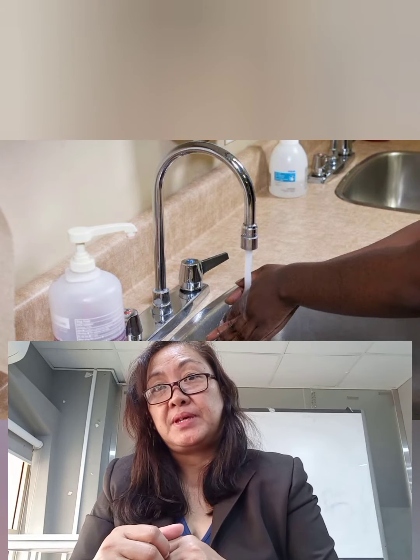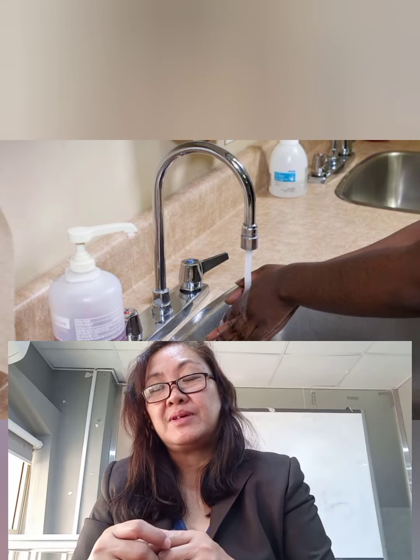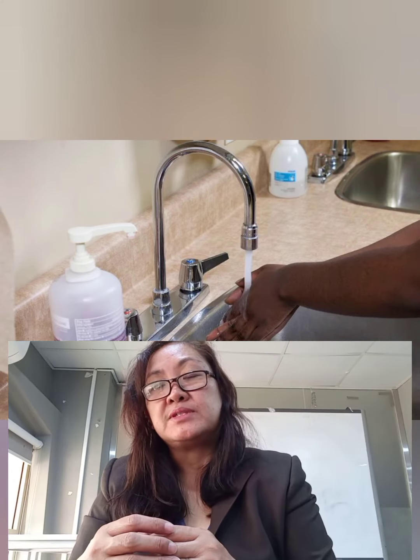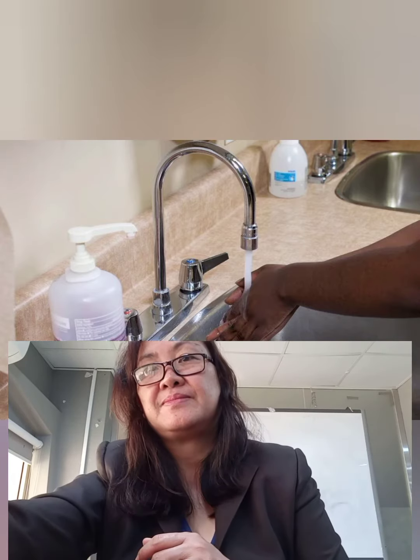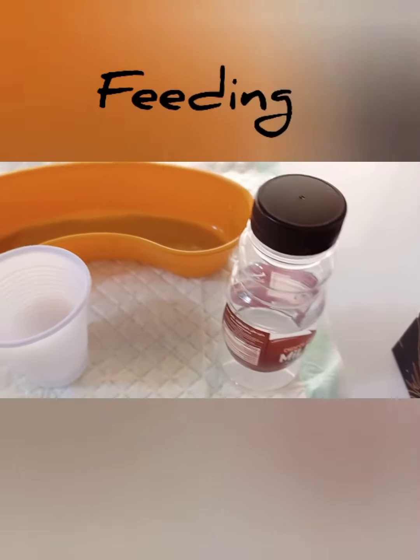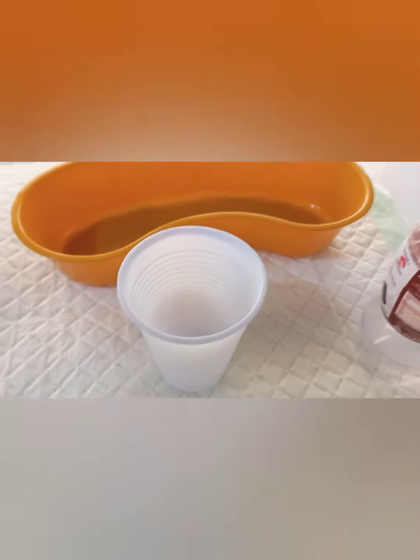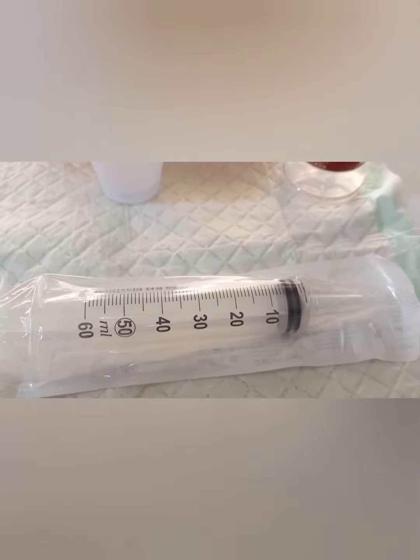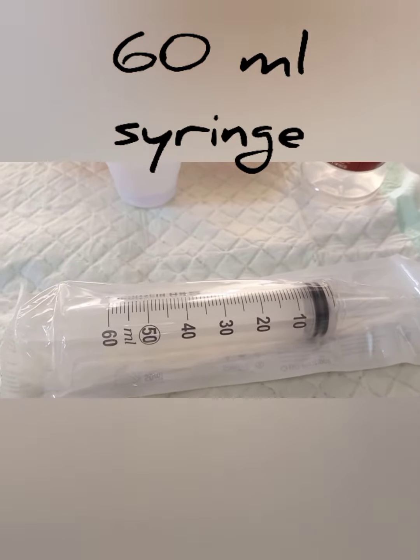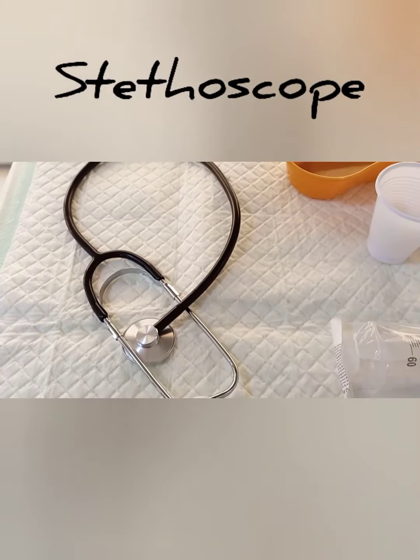The first step in giving your NGT feeding is to do hand washing. Wash your hands well with soap and water and dry it carefully with your paper towels. You need the following: the feeding, a cup of water, a 60 ml syringe, your stethoscope.